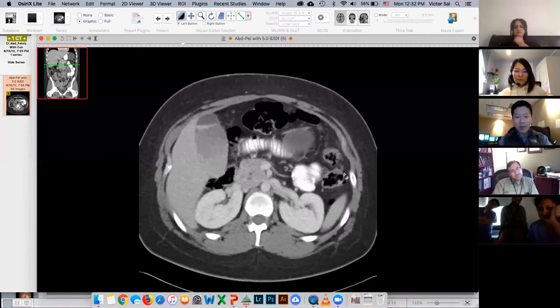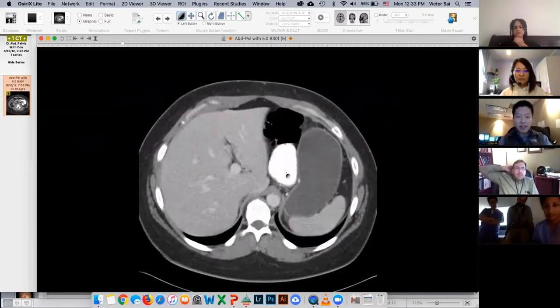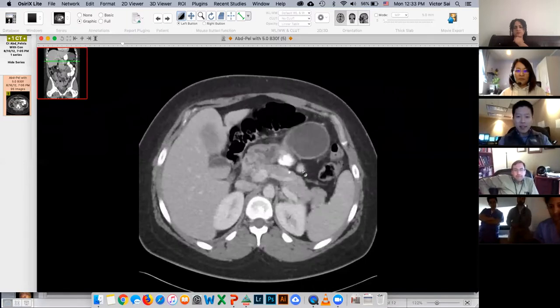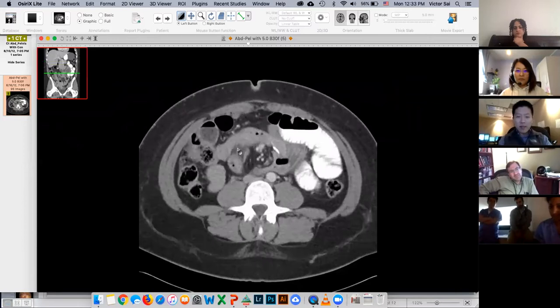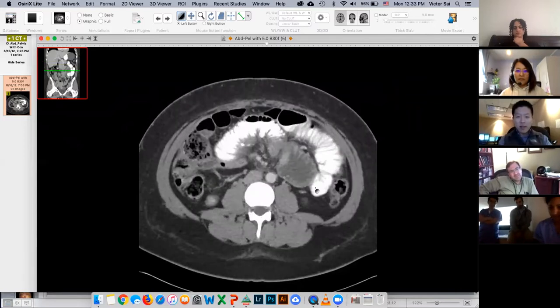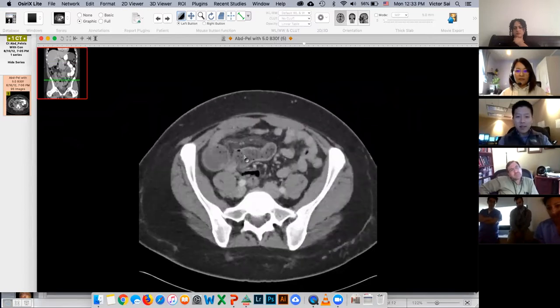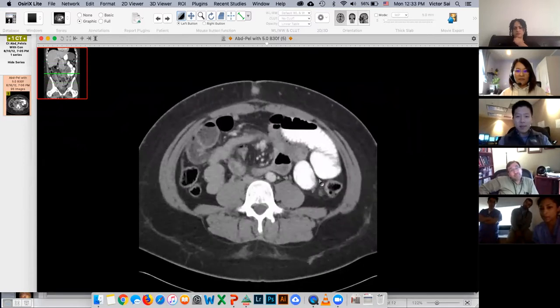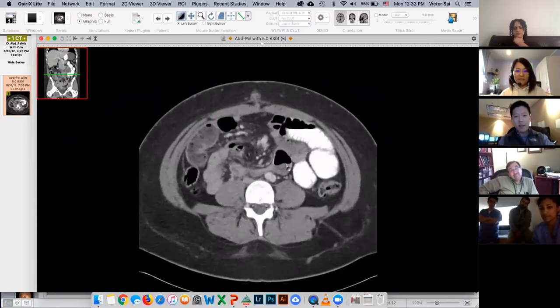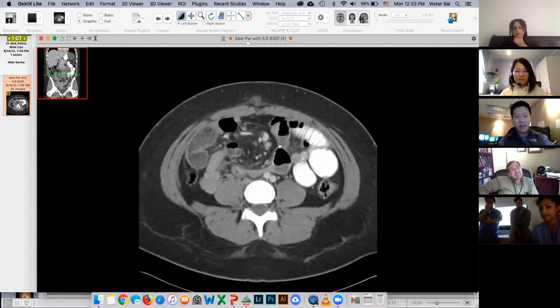This is a 31-year-old woman who also had Roux-en-Y gastric bypass. You can see the enteric contrast that she was given kind of leads to this point here. Internal hernia. Yeah, where there's this hernia and this segment of bowel not looking happy, and all the distal bowel decompressed. So this is right at the JJ, which is where many of these tend to occur.